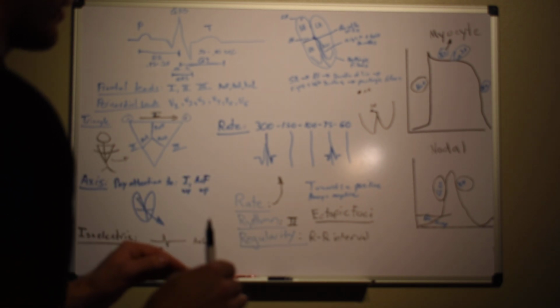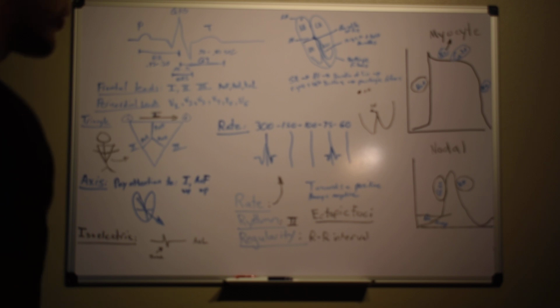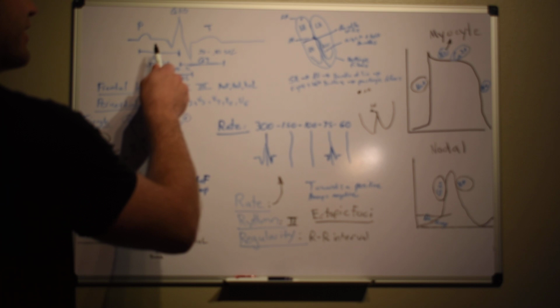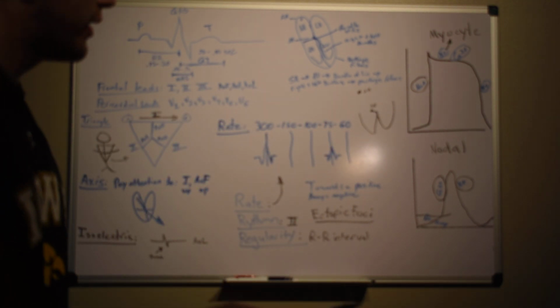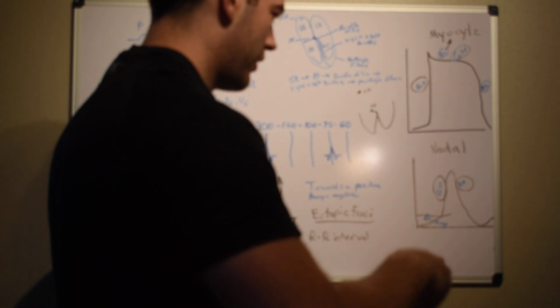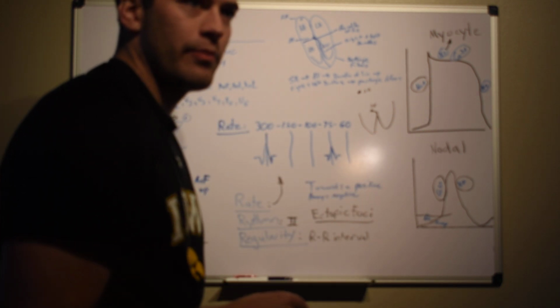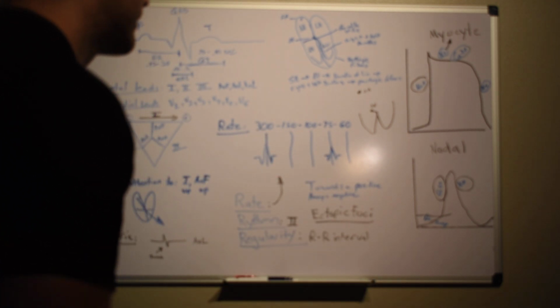All right, so EKGs get kind of hard. So we think about these and we look at the waveforms on the graphs of how each action potential is moving. And we think, well, why, whenever I see an EKG, does it look like this? Why doesn't it look like that? Well, it's just a matter of perspective. It does look like that if you're measuring it from one cell. If you stick a probe right into the membrane of the cell, it does look like that, because you're measuring it just from the ions moving in and moving out.